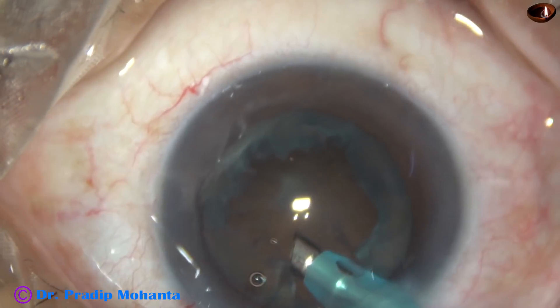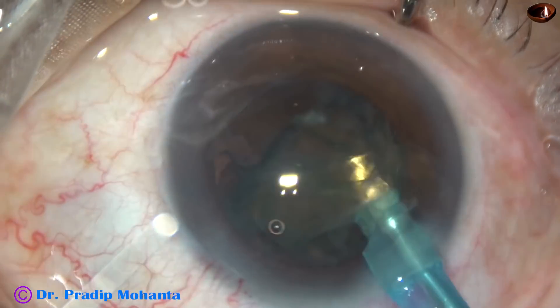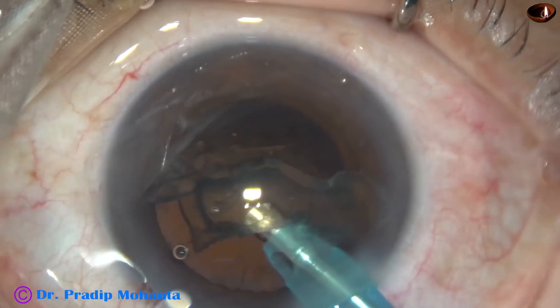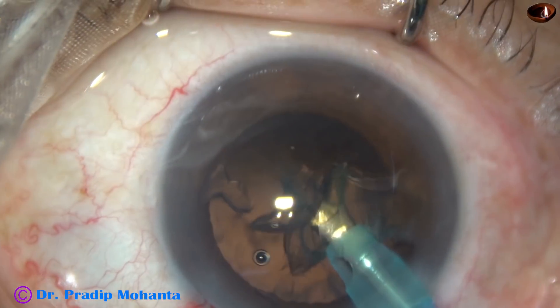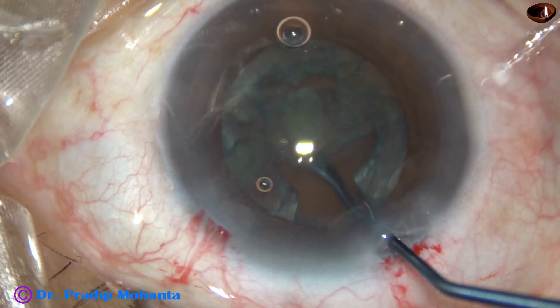If we don't do this and try to catch hold of this soft lens plate directly, there is a high chance of causing posterior capsular rent. Epinucleus came out very easily in this case. So in soft cataracts, we must not try to catch hold of the lens plate with the tip of the FACO handpiece. We must use a spatula kind of instrument to lift up the lens material and then emulsify it.